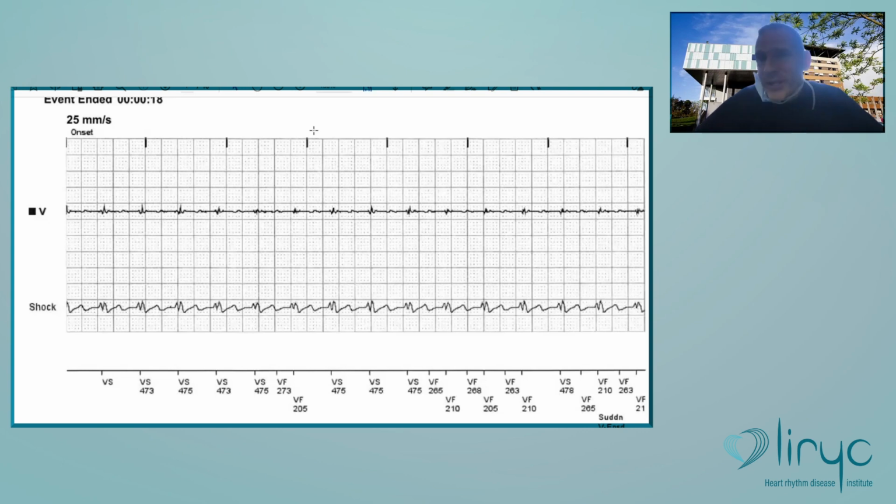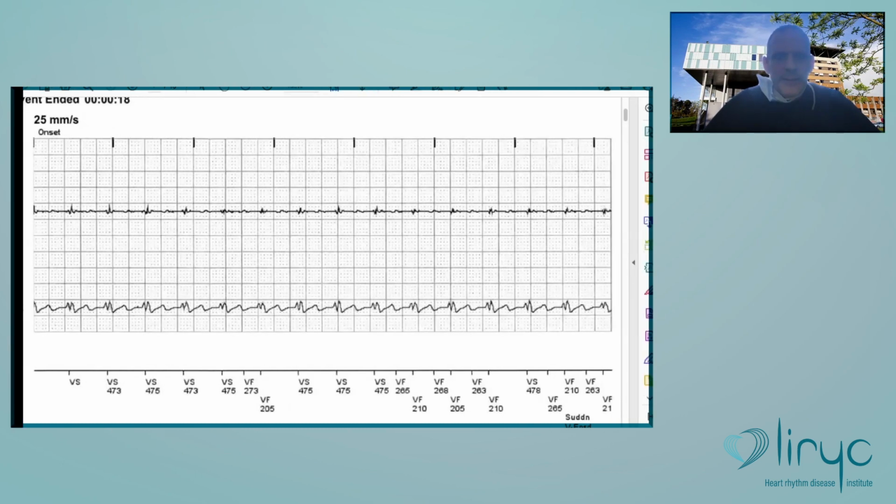So, for example, in Medtronic, you have the possibility to program a specific algorithm to diagnose the problem of T-wave sensing and inhibit the therapy, so decrease the amount of inappropriate therapy. But I think that there must be a reason why in Boston you don't see this kind of thing, and I think it would be a good idea if it could be corrected in the new Medtronic or Abbott devices. Okay. No question.